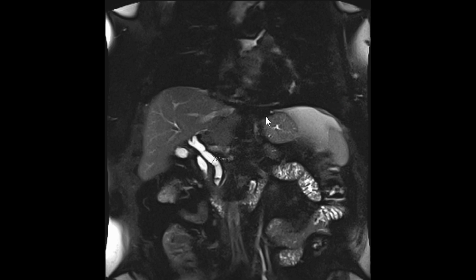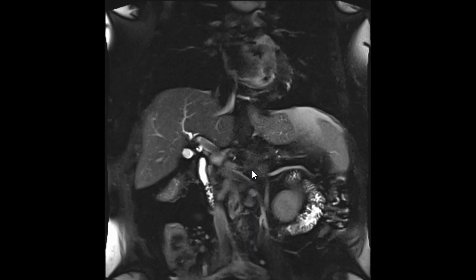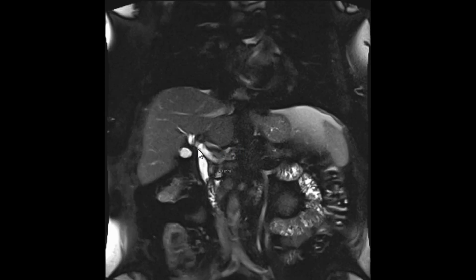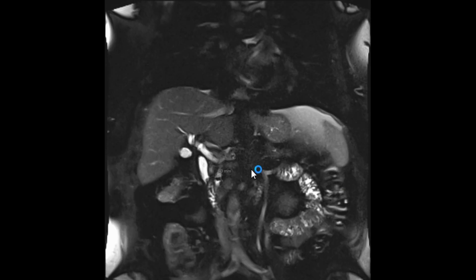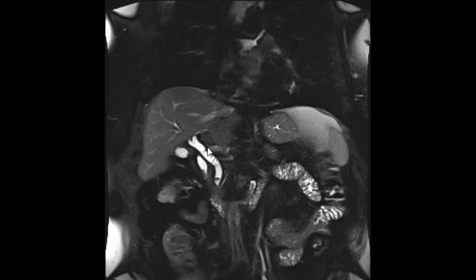Here is the normal case — ignore the 0.8 cm stone in the distal CBD for now. This is the neck of the gallbladder, and you can see the cystic duct coming off here and inserting into the common hepatic duct. The part of the duct below that is all CBD, and it has been correctly measured here at 0.9 cm — the prominence is related to the stone. Above the cystic duct insertion is common hepatic duct; below is CBD. You wouldn't measure CBD above the cystic duct insertion.